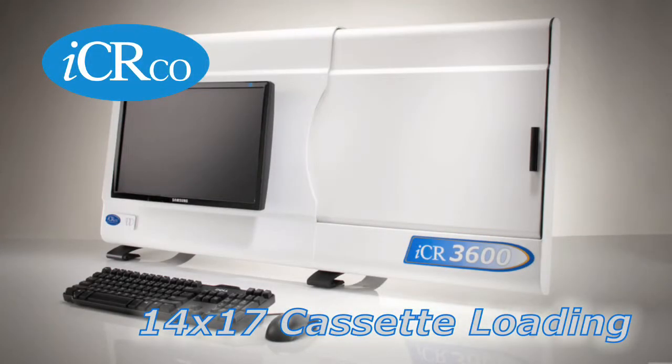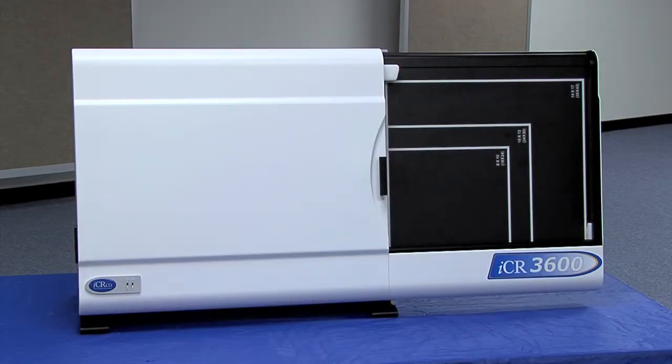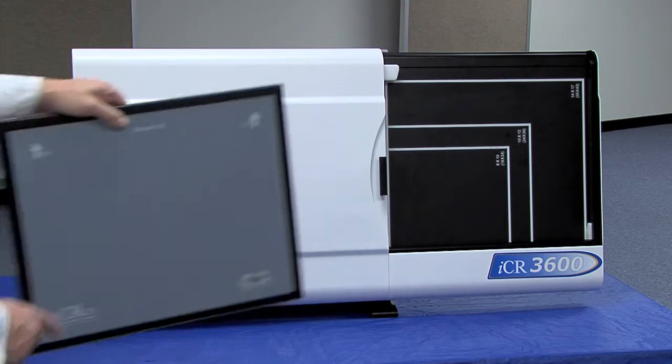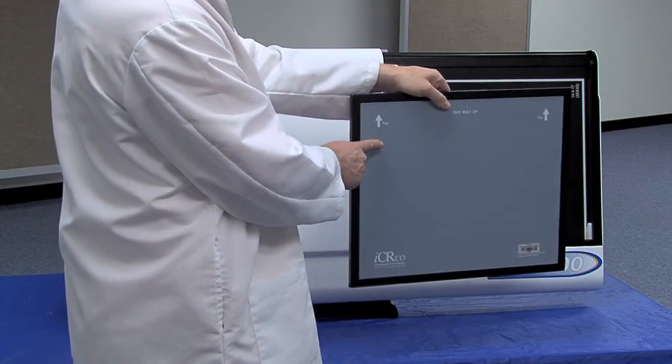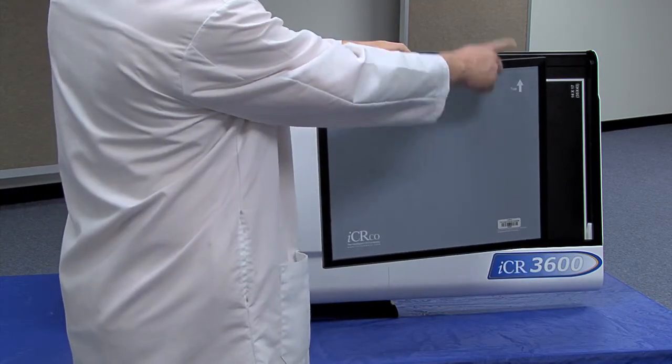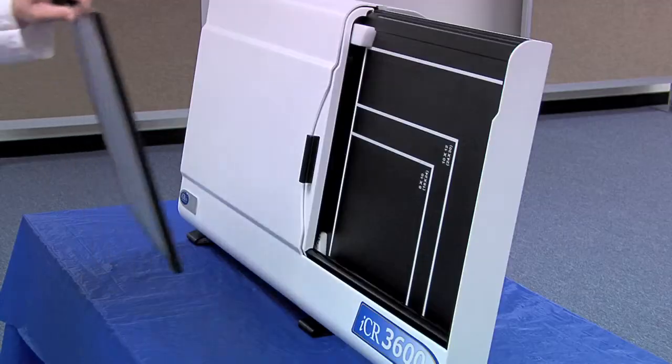Loading the 14x17 cassette in the CR3600 series. To load the 14x17 cassette in the CR3600 series scanner, make sure the arrows on the front of the cassette are facing out and pointed upwards as indicated.